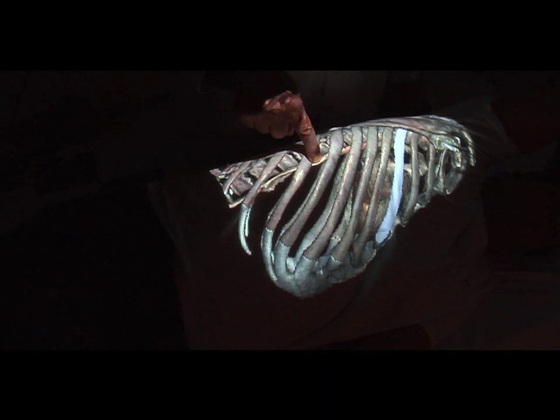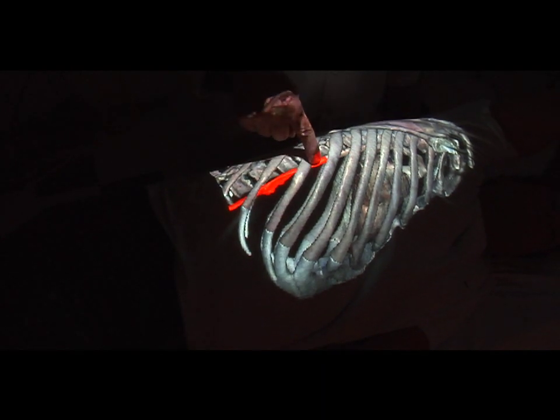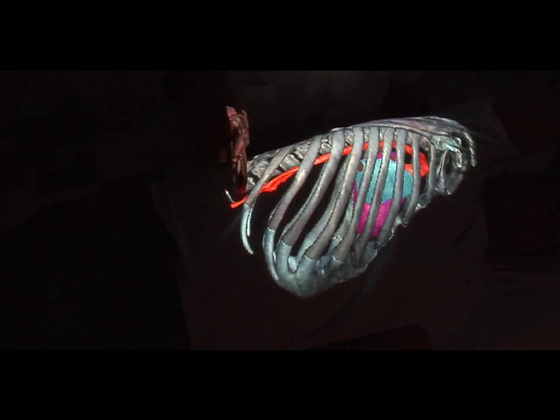For example, examining the chest from the patient's side, students can clearly see the path of the aorta along the anterior spinal column.